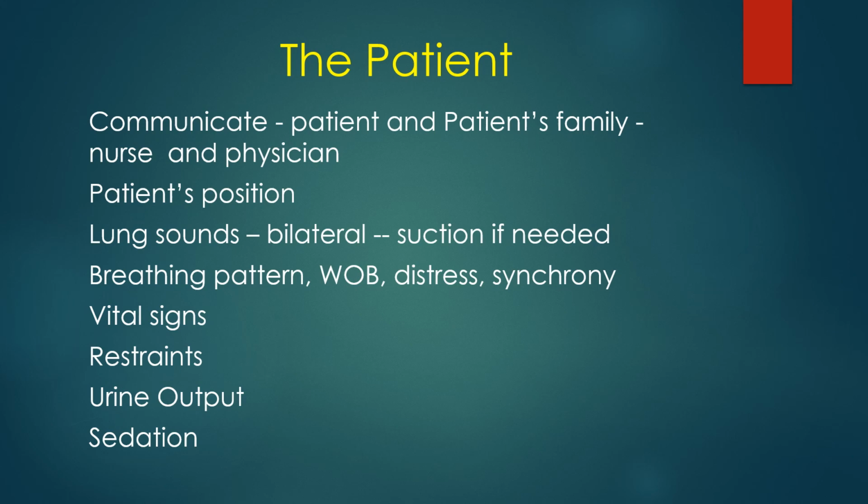We want to look at the patient, see if he's showing any signs of distress, if he seems to not be synchronous with the ventilator. Sometimes it helps to put your hand over the patient's abdomen and watch the ventilator and feel the patient's breathing at the same time, and you can tell sometimes that the patient and the ventilator are not in sync.